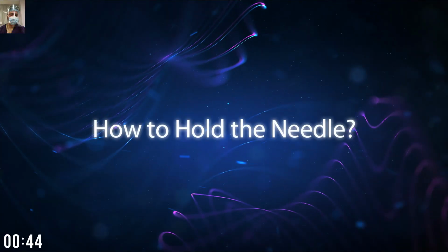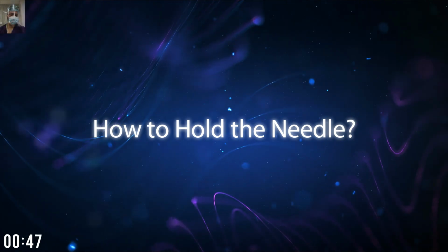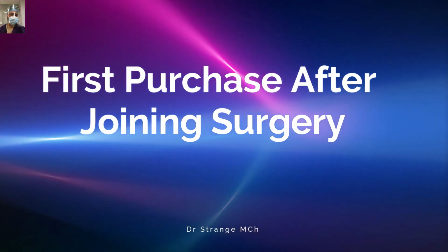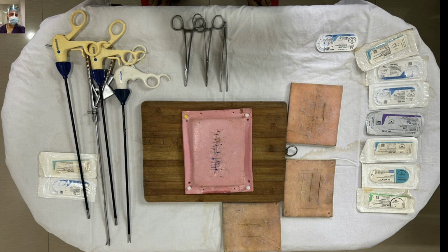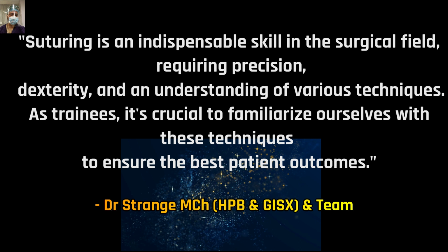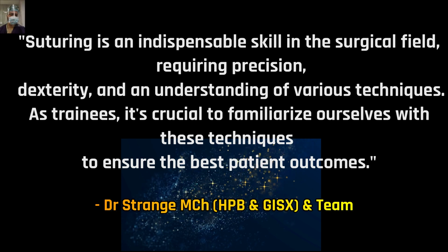We'll also discuss the indications and advantages of each technique, giving you a comprehensive understanding of their practical applications. So be sure to check the first part in which we delve into the fundamental setup of suturing and explore the different tools used in the art of suturing. If you missed it, be sure to check it out before joining us here today. And now it is time to take our skills to the next level. So friends, suturing is an indispensable skill in the surgical field, requiring precision, dexterity, and an understanding of various techniques. As trainees, it is crucial to familiarize ourselves with these techniques to ensure the best patient outcome.